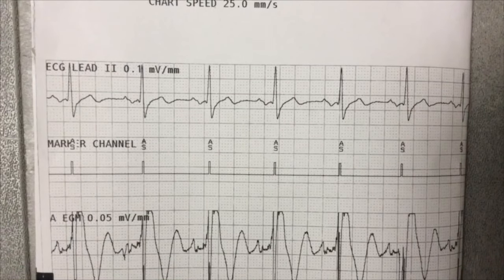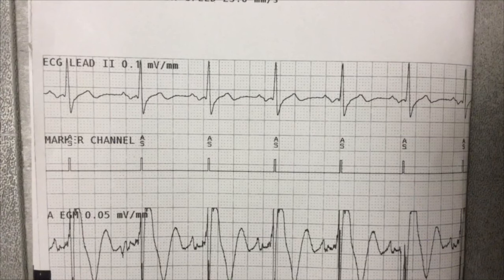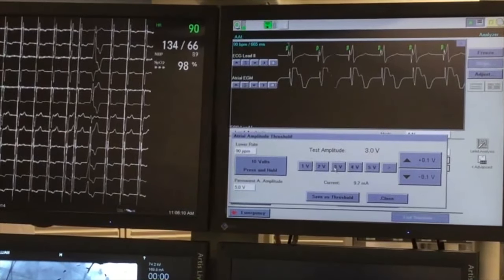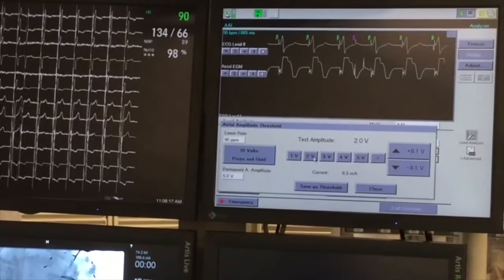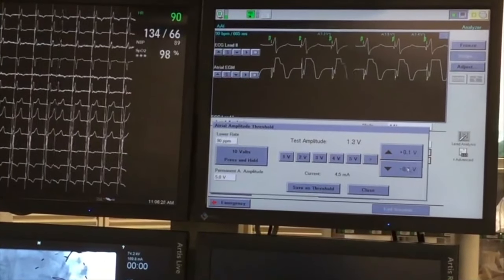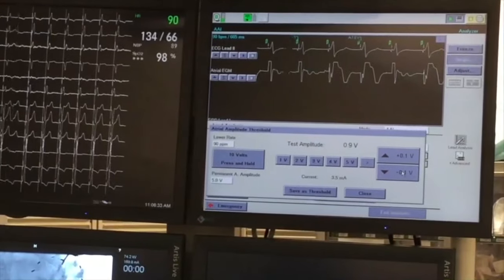In this case, at high output pacing, there is more his-bundle recruitment with minimal fusion. We term this non-selective his-bundle pacing. As the output is reduced, the QRS is widened, but there is still his-bundle recruitment resulting in non-selective his-bundle pacing. It is very important to pace at varying outputs as various responses can be seen. At high output pacing, pure his-bundle recruitment can occur in cases where there is a naked his-bundle. More commonly, at high output pacing, there is fusion with the local myocardium and his-bundle capture. As pacing output is reduced, selective his-bundle capture can occur at very low outputs. In fact, very selective pacing off the right bundle or left bundle can also be demonstrated with reducing outputs.